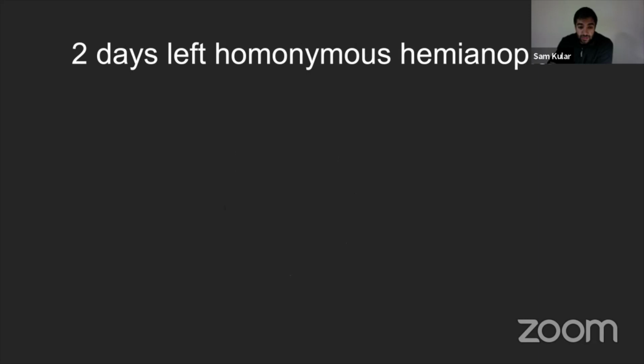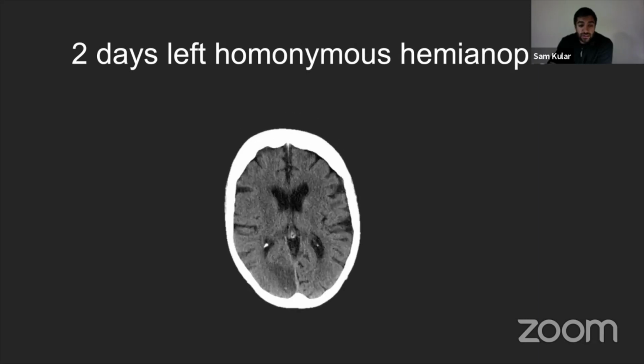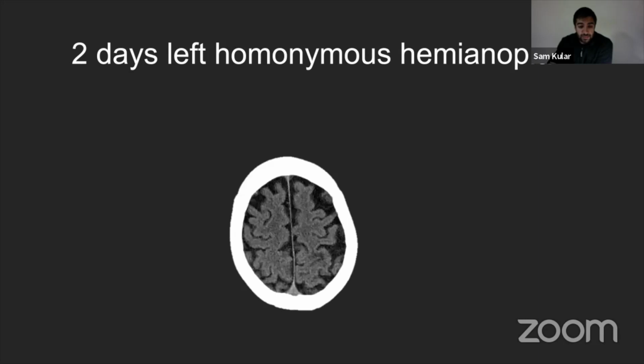So I'll just go through the image a few times and see what, if anything, can be seen.